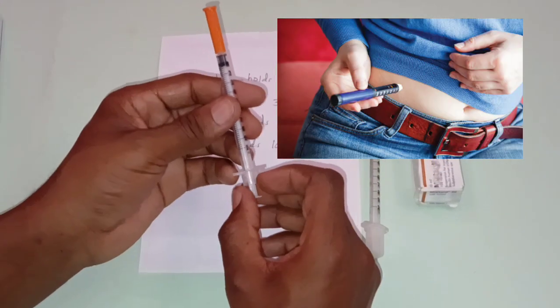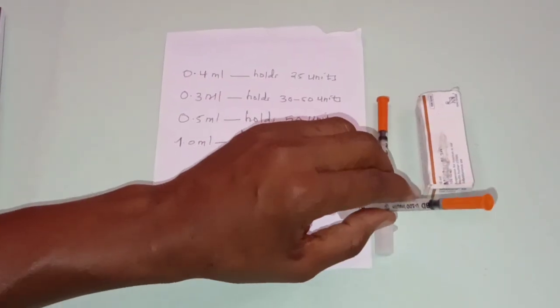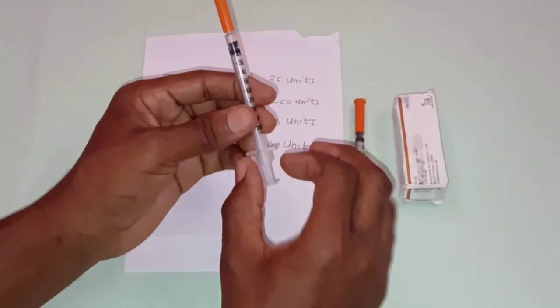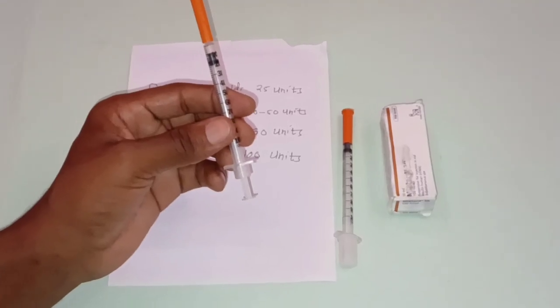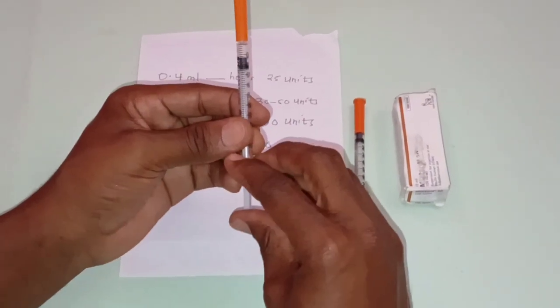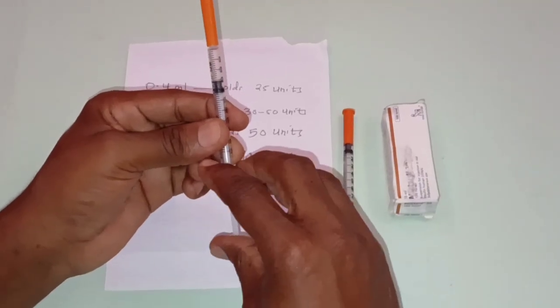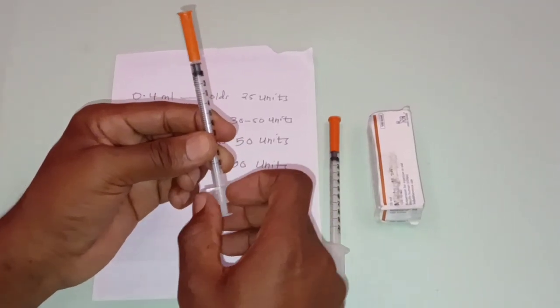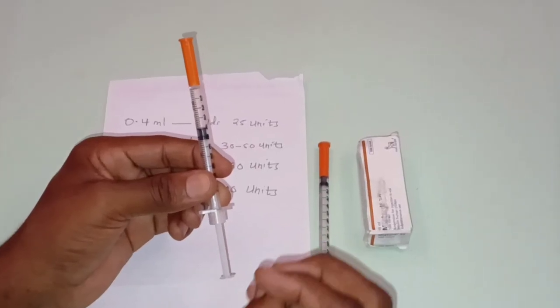Insulin injection is generally given into the upper arm, that is the upper shoulder. It's also given in the abdomen, where there is fatty tissue. It's also given in the thigh. So that's the thigh. So these are the three main areas where the insulin injection is administered.